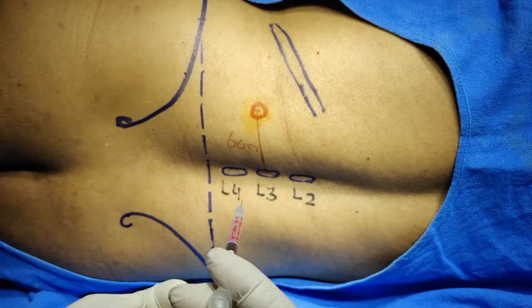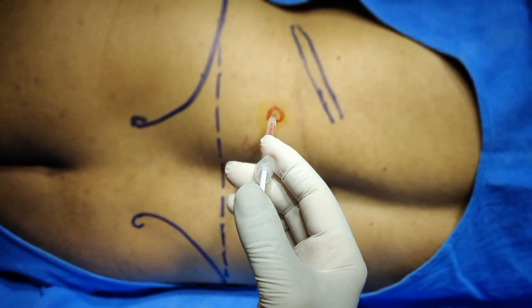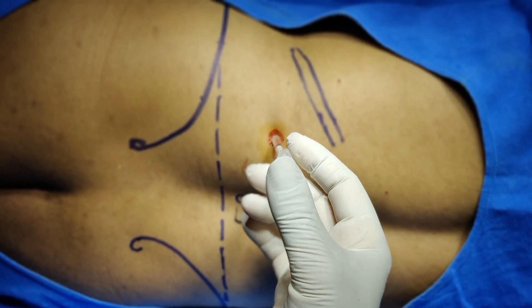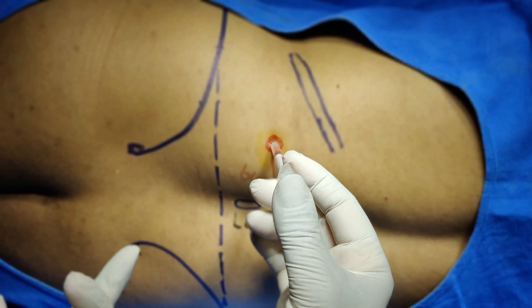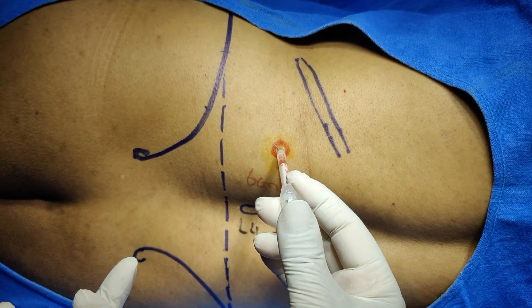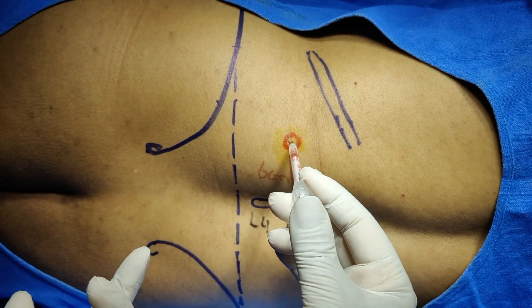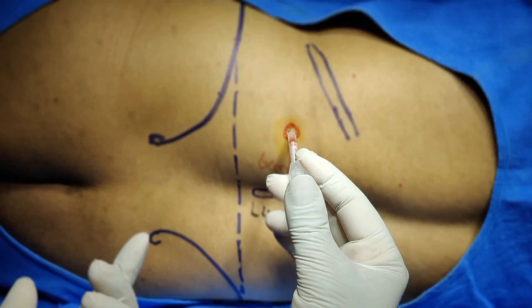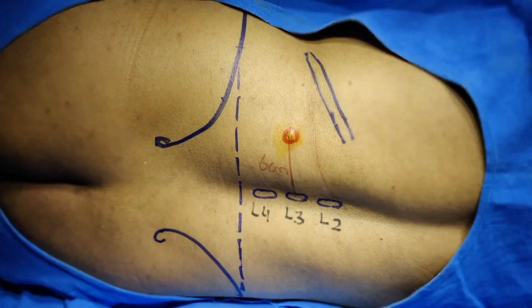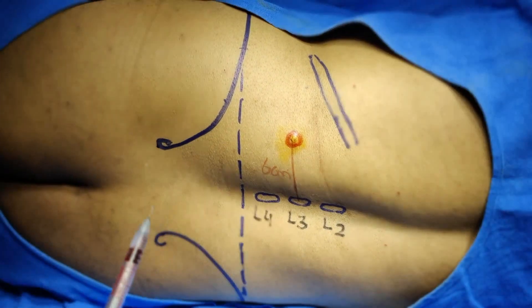Initially, anesthetize the entry point of the needle using a small 31-gauge needle. Inject in a subcutaneous plane, wait a few seconds, then withdraw to the dermal level and give an intradermal injection. Wait for the skin to become anesthetized — you can notice a dermal bleb indicating that the skin and a little soft tissue are fully anesthetized.